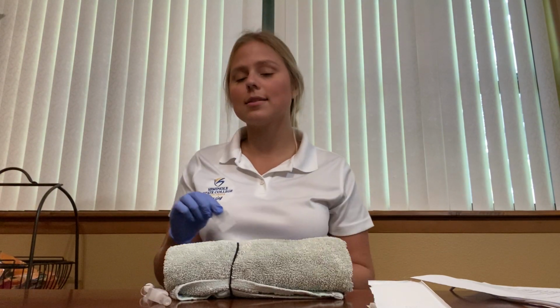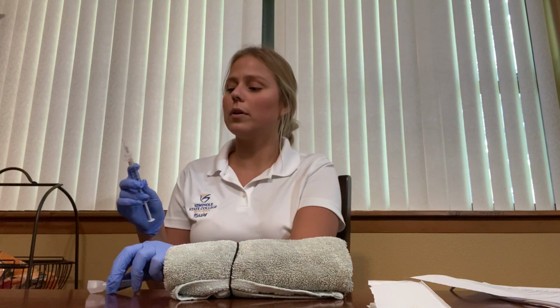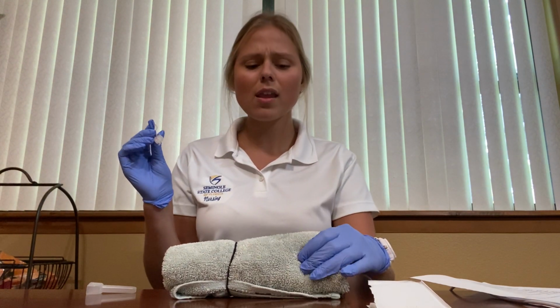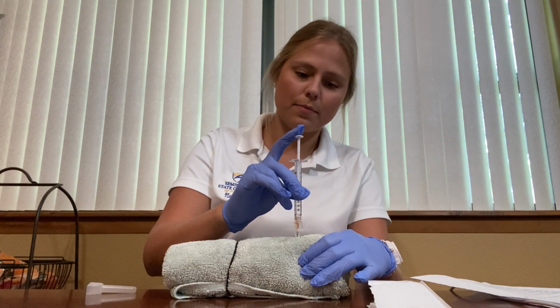Okay, 30 seconds. I'm gonna let that air dry. I'm not gonna fan it with my hands or anything. And then at this time, I would safely uncap my needle and I will hold it like a dart. I'm going to pinch the skin, and since I'm able to pinch a solid 1 to 2 inches of skin, I'm going to inject it at a 90-degree angle. So insert my needle, push the med slowly.